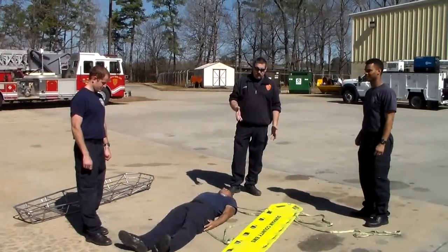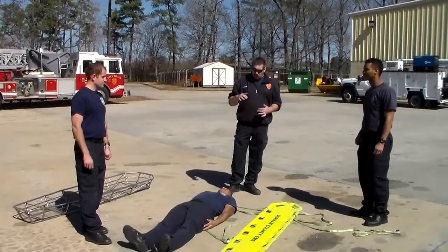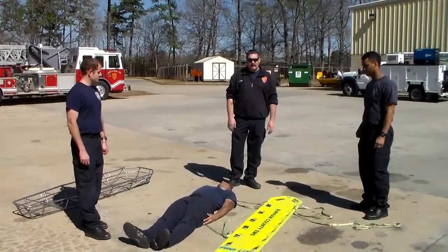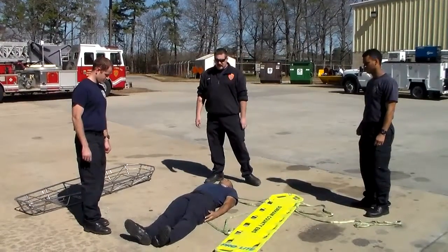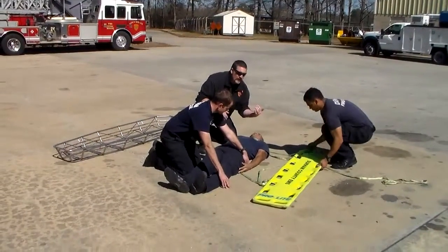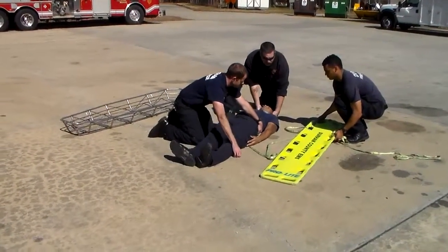Hello everyone. Again, we're talking about internal lashing on a backboard. All we're going to do is show you full speed what it would look like if we're on a call. Jonathan is our patient, myself and Dave — Jeremy is going to be the one who's going to grab our basket and toss it. I'm going to sit here and hold Jonathan's c-spine like we would.